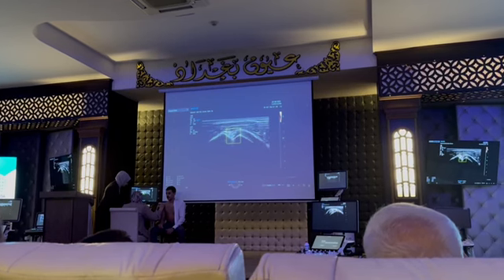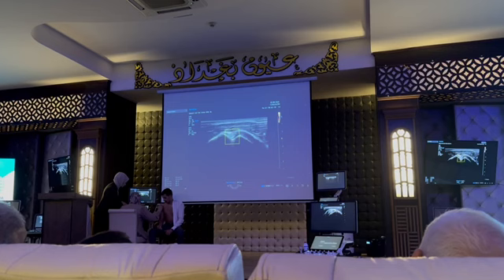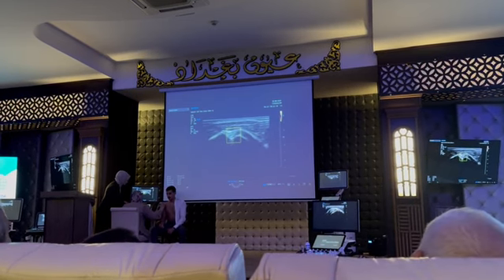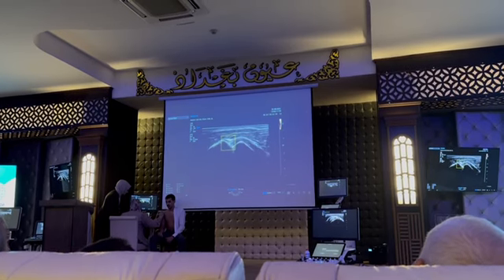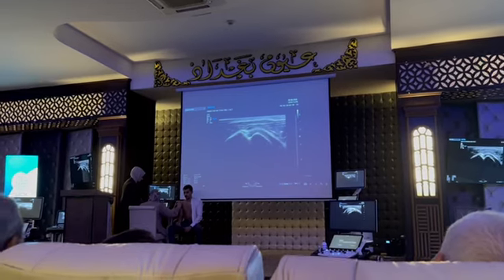A pulsating vessel should appear here by power Doppler. This is the humeral circumflex artery. You see, this is the bicipital tendon. I am now perpendicular on it. I'm now perpendicular on this muscle.